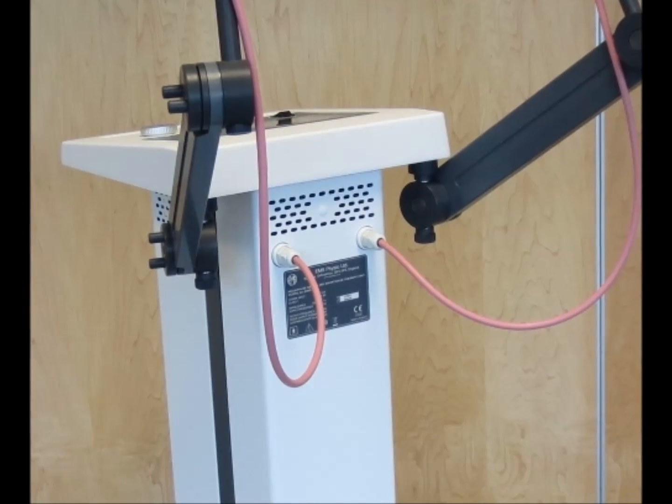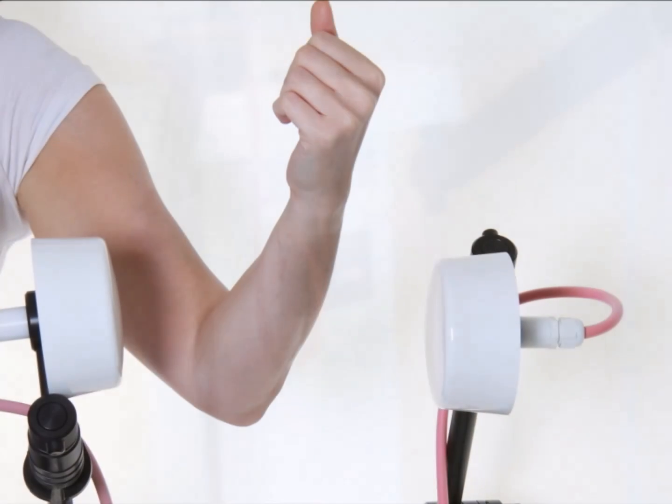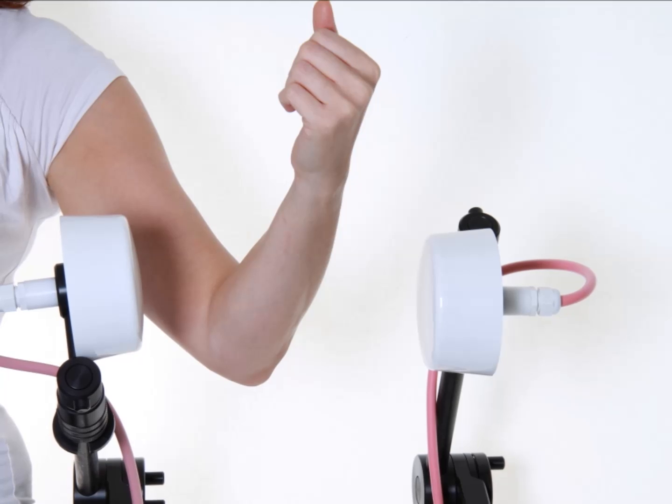First, plug the electrode cables into the socket at the rear of the device, ensuring a correct tight fit. Connect the unit to the mains power and position the electrodes over the site to be treated.